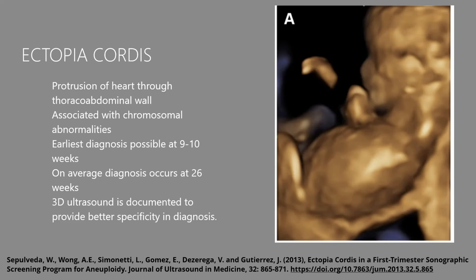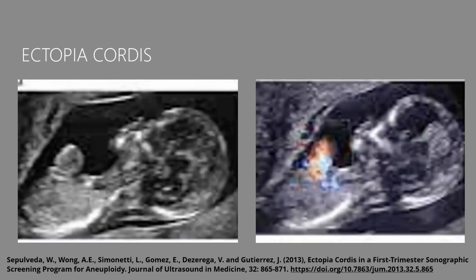Color Doppler imaging is also used to visualize the heart, confirming it is functional and has blood flowing through it. This helps differentiate the protruding heart from other structures such as intestines, which might be seen in conditions like gastroschisis, ensuring proper diagnosis.